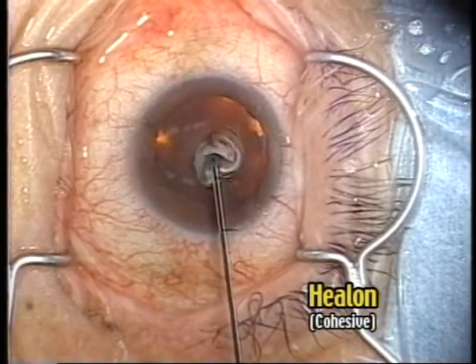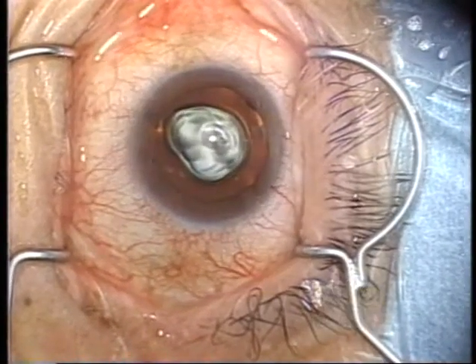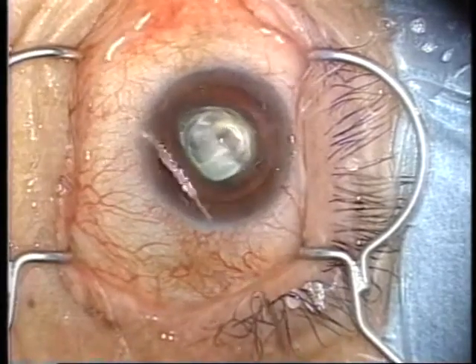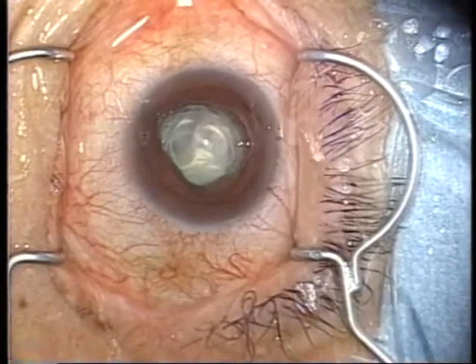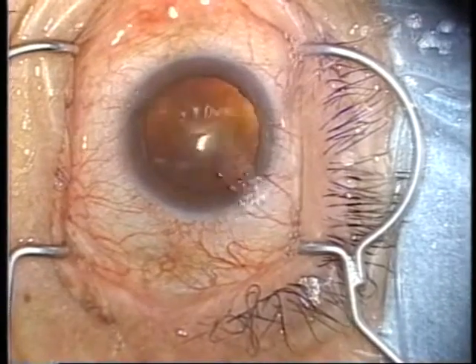This video picture shows how helon is used in actual surgery. As you can see, helon takes an elevated shape and does not become uniformly flat. It easily slips off the cornea and cannot form a beautiful wet shell.